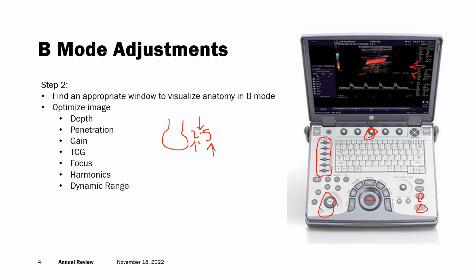Just by tracking back on the trackball, we call it cine-ing back, you can track it back and you actually get more images as you track back through the memory than you ever saw on the screen in the first place. So sometimes that's a great option if you feel like you just missed something or something's not quite as clear as you'd like it to be, to go ahead and track back. Just a warning, that gets to be quite the temptation sometimes, where all of a sudden you're imaging and every single image you take you're tracking back, which can eat up a lot of time.